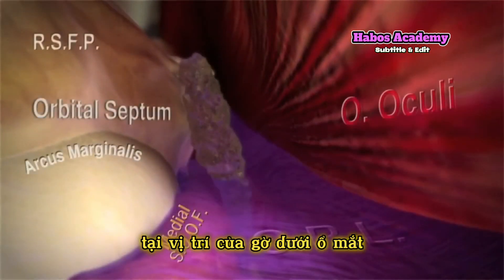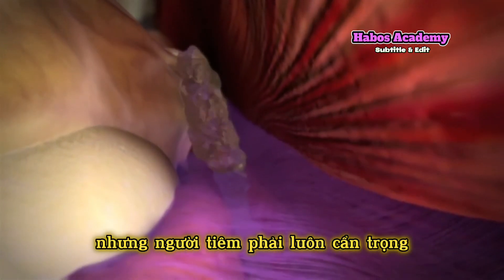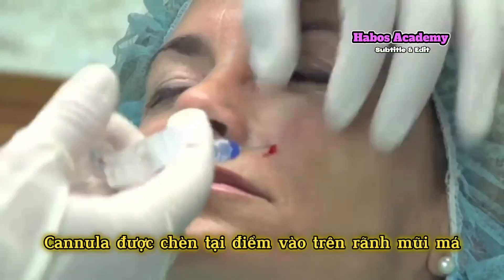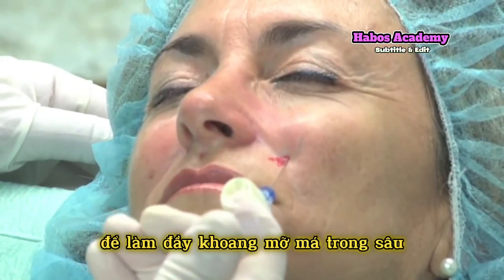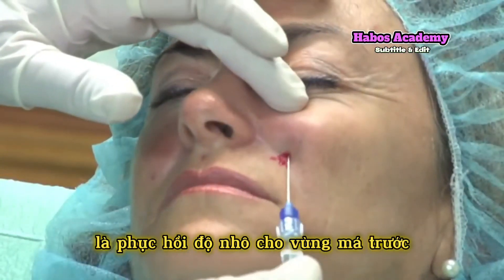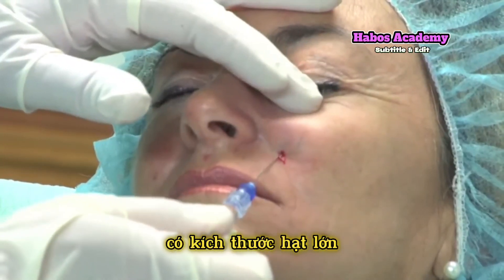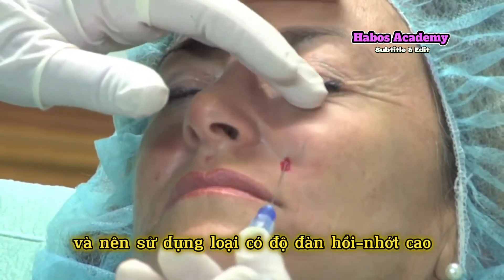At this level of the orbital rim, the cannula can pierce the orbital retaining ligament in some instances, but the injector must be cautious not to inject the retroceptal fat pad. In this patient example, the cannula is placed through the nasolabial port and passed deep to volumize the deep medial cheek fat compartment. The aesthetic goal is restoration of anterior cheek projection and restoring medial mid-facial support. Fat or commercially available filler with large particle size, higher G prime, and increased cohesivity are recommended.